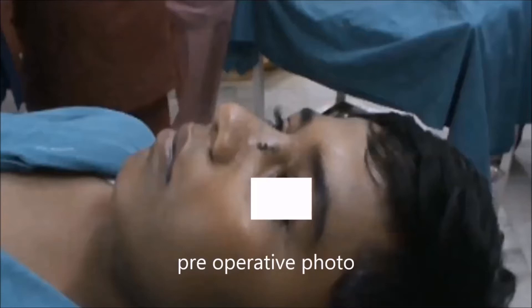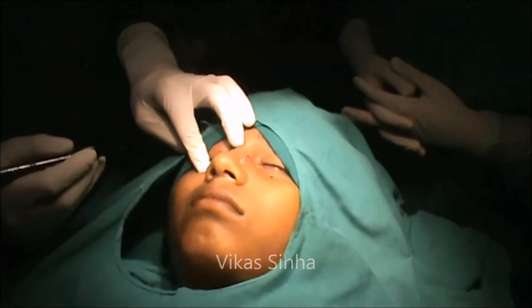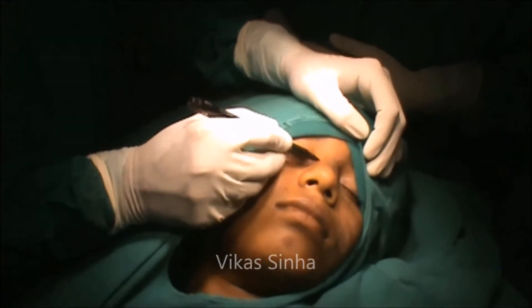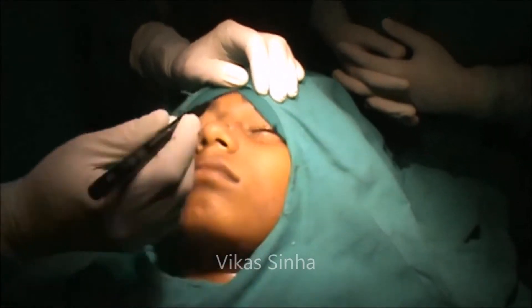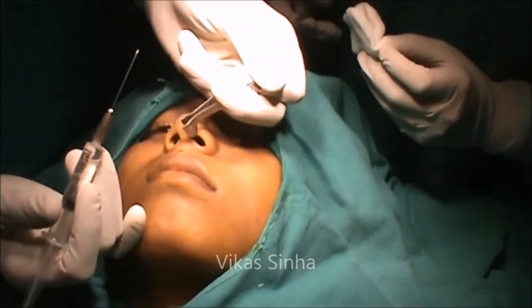I will show you the diagram showing the different nerves which are to be blocked for the local anesthesia. Now I am marking the infraorbital nerve on both sides. This is the infra-trochlear nerve and the external nasal nerve. And this is for the nasal branch of the greater palatine nerve.